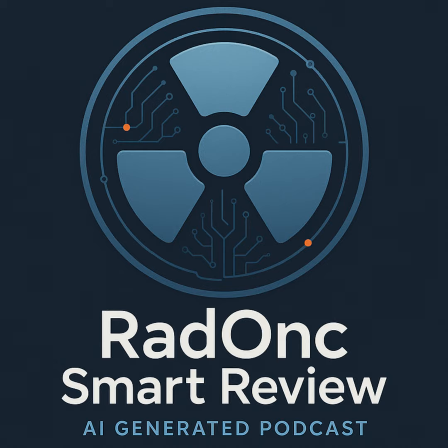Noise. Yeah. This is the grainy or mottled appearance you sometimes see, especially in low-dose scans. It looks like static or fuzziness. What causes noise? It's mainly due to quantum mottle, the random statistical variation in the number of X-ray photons detected per voxel. Fewer photons detected means more relative fluctuation, more noise. So how do you reduce noise? The main way is to increase the mAs, use more photons, but that increases patient dose.